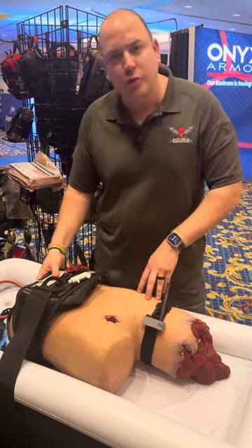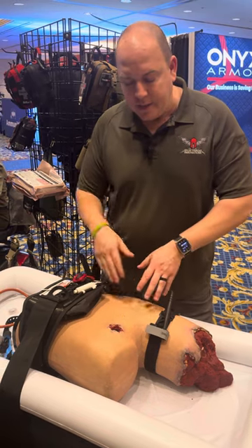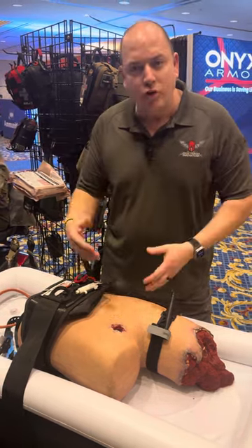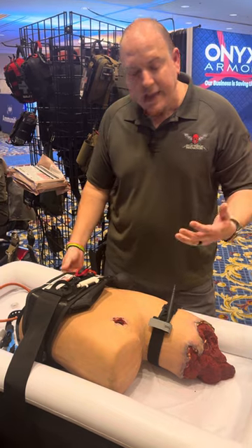This is currently the only FDA-approved junctional tourniquet that can work in multiple sites, to include both the inguinal area, the abdominal aorta, and the axillary area. It also works as a pelvic binder.